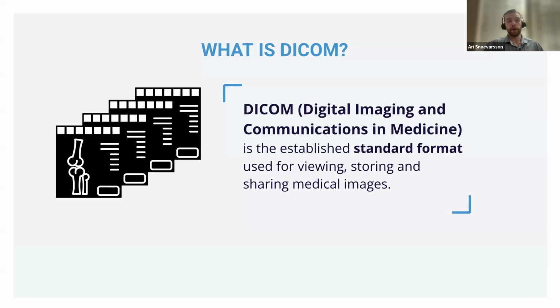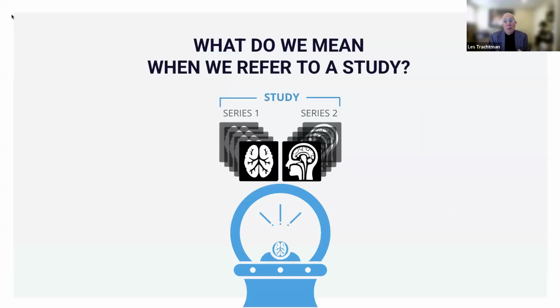And that's a helpful description. When we talk about what DICOM is and how it shows up, so you're looking at it in a viewer, we sometimes see it in terms of studies, series, slices. Can you help us break down what those terms mean? Sure, and these are terms that are probably worth understanding, but you don't have to know the real technical details of it. So a study is typically a patient comes in for an exam and a scan is done. That's typically a study. We call it a patient on a modality in a session.